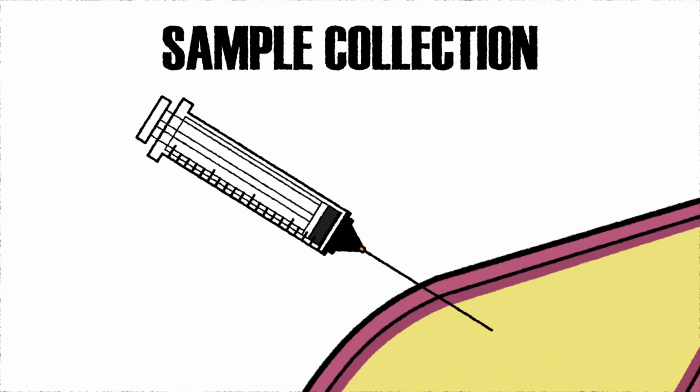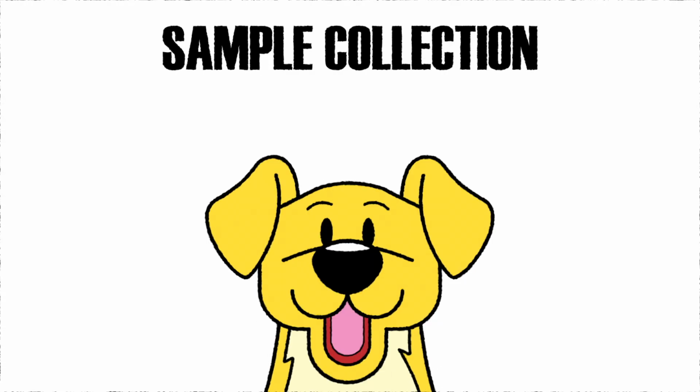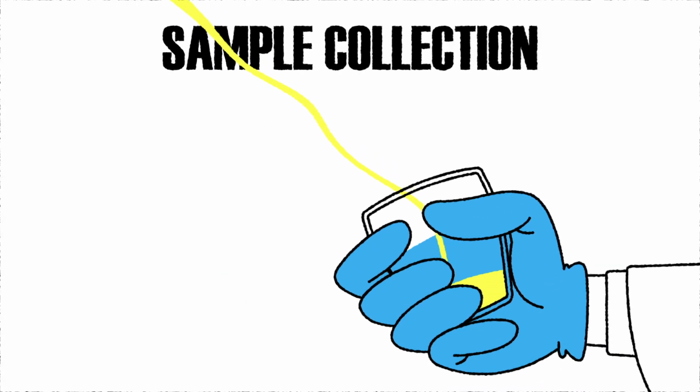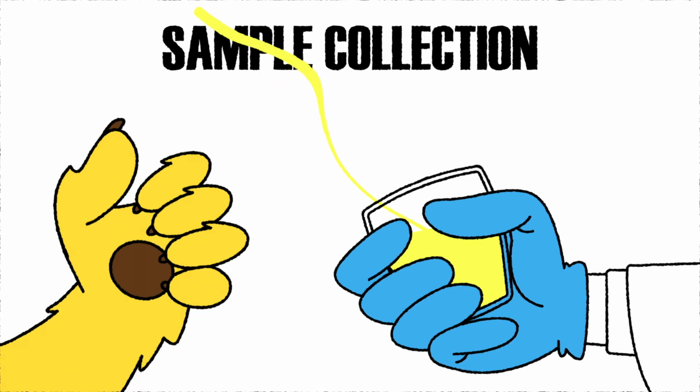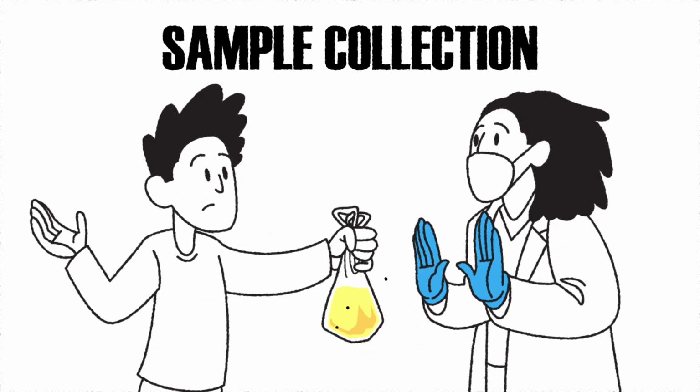What do we need to know about sample collection and submission? For quality results, provide good quality samples. Minimize contaminants by using cystocentesis for urine samples. If that is not possible, like for a wiggly Labrador retriever, a clean midstream urine sample collected by veterinary staff in the clinic is okay. Just don't submit urine from an owner-collected sample.